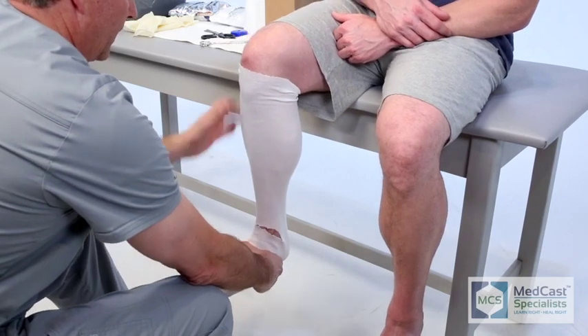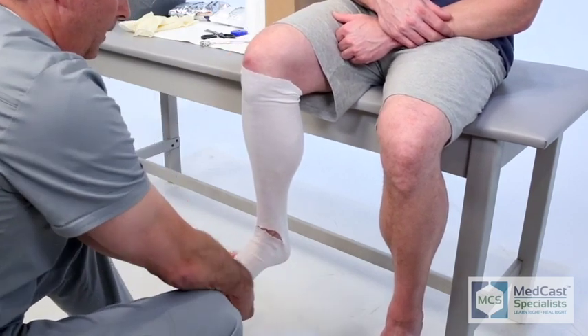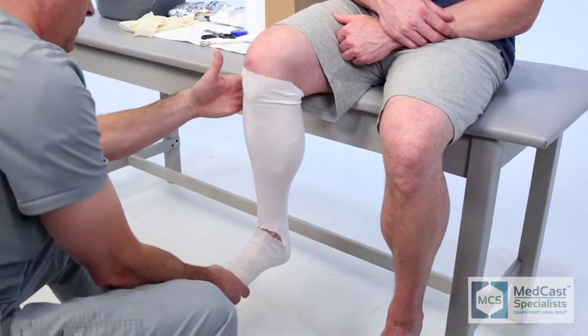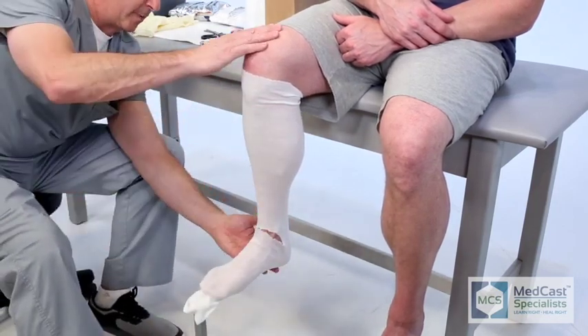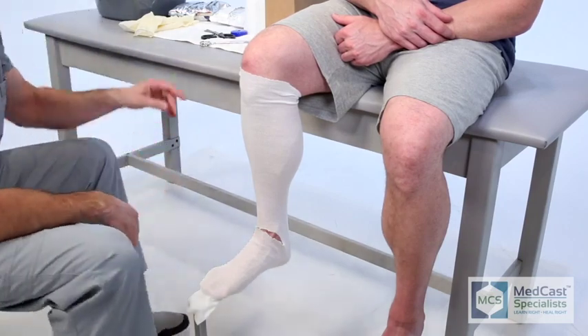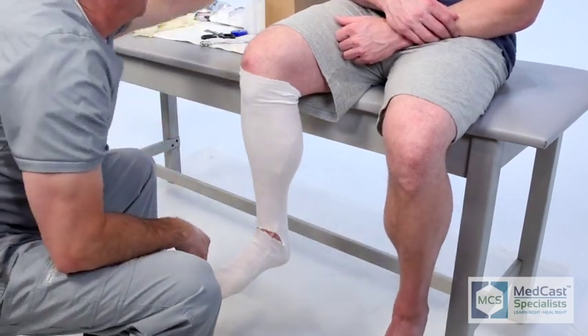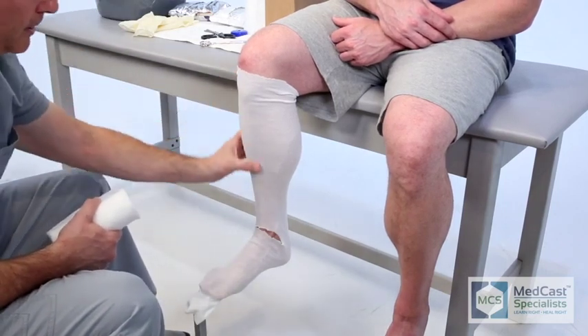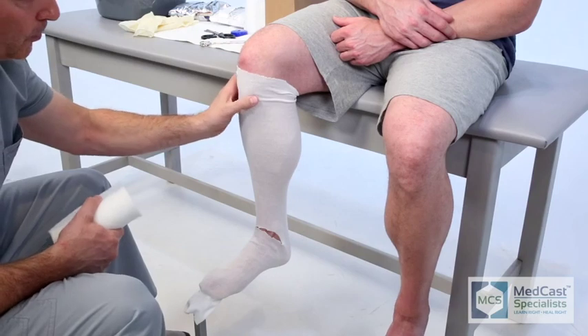I apply the foot onto the cast stand and I always have them pointing the knee right at my chest. Make sure that alignment stays there and you can talk them through it. We have the contralateral side and the opposite foot on a foot stand to help balance the patient so that they can approach the edge of the cast table without feeling like they're going to fall off or lose their balance.